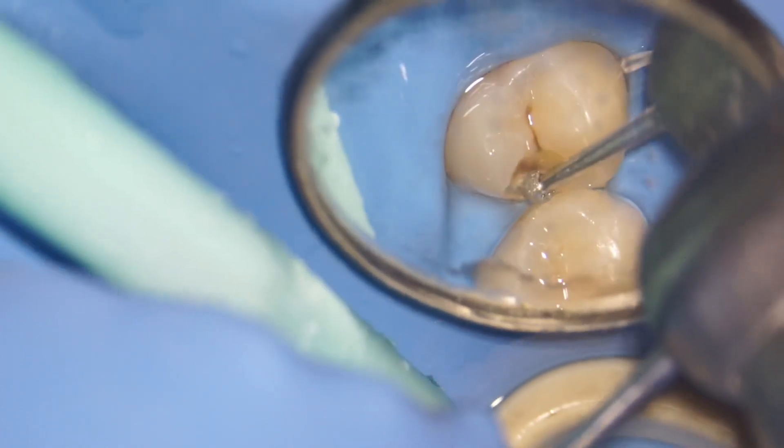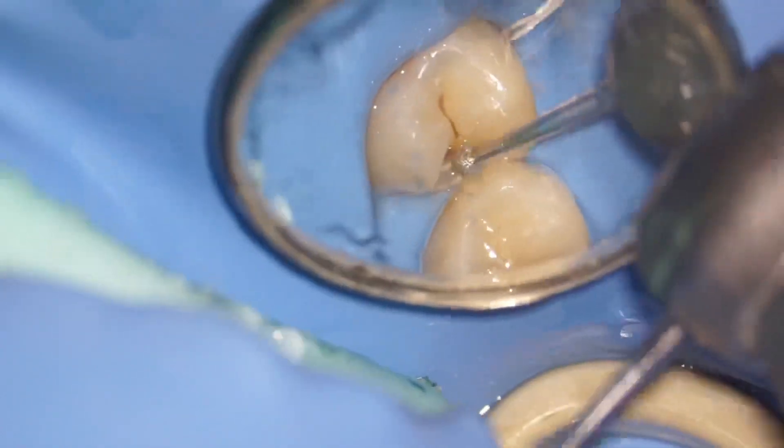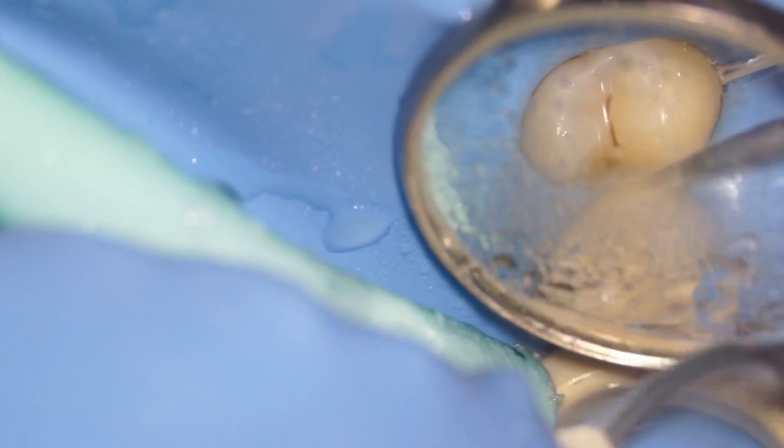I continued my caries removal using a long-shanked round diamond bur. As I always say, the long shank is because I want to have much better vision. Using a microscope, you get to see a lot, so that is why it's preferable to use a long shank.